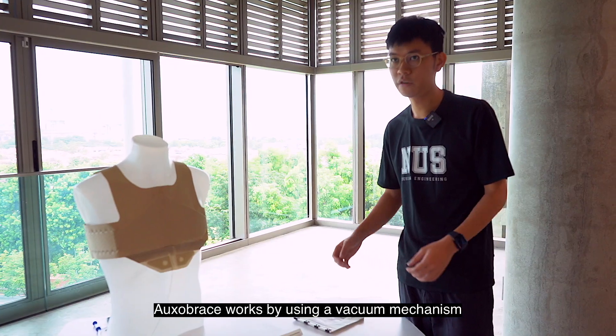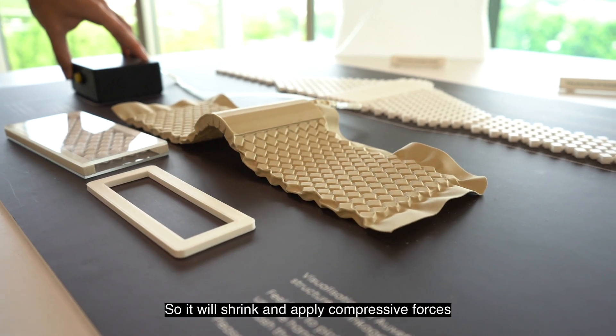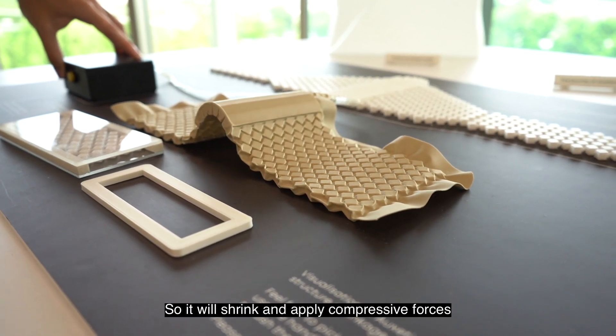Auxobrace works by using a vacuum mechanism to actually evacuate air out of these pocket bladders, so it will shrink and apply compressive forces towards the sternum bone.